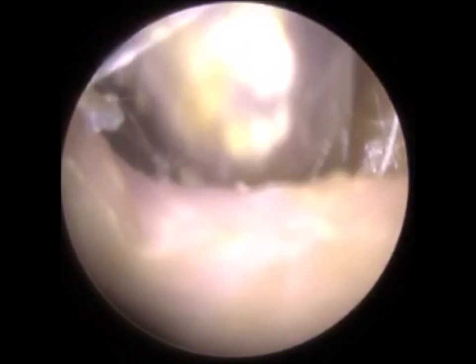And I'm just using the Henkel forceps again, just to remove this keratin. That piece of keratin is a bit firmer, a bit crustier, and lends very well to forceps because you can get a good grip. But softer keratin, spongier keratin, it's not as effective because it just tears it. It just cuts it and shreds it. So just using a standard Zoellner suction probe here. And you'll see again, I'm going to be switching between instruments.